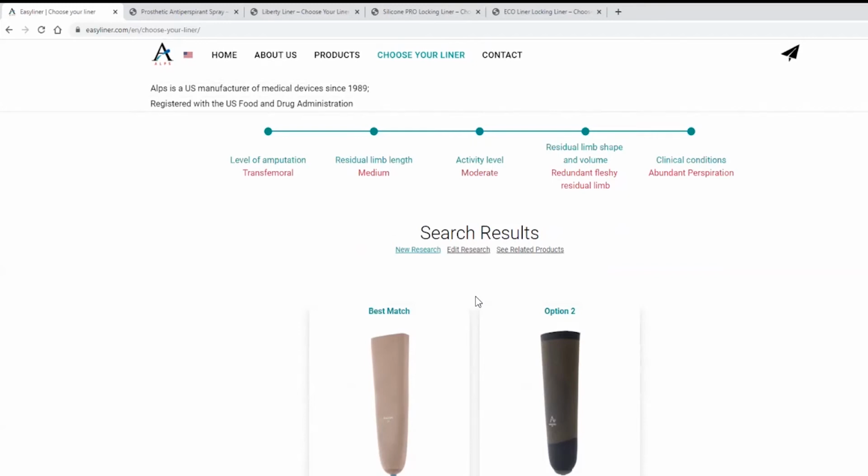That just recently came up as we were working with this and doing kind of a soft launch of this. Right now it is a little more biased towards a pin system because it's more stable in the global field. We found more prosthetists using it on the global side of things. The benefits of a vacuum suspension are there, so being able to choose that and differentiate it is something that we're looking at expanding with this program.